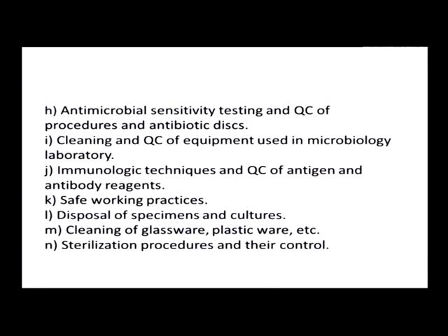Then after the appropriate identification, how we are going to perform the most important part, that is interesting to the clinicians. They want to know what antibiotic this pathogen is susceptible to. So that is where our role lies. So we must use appropriate control. So you must have the antibiotic disc QC being performed, and also the susceptibility test according to the CLSI guideline you need to follow, which keeps changing every year.